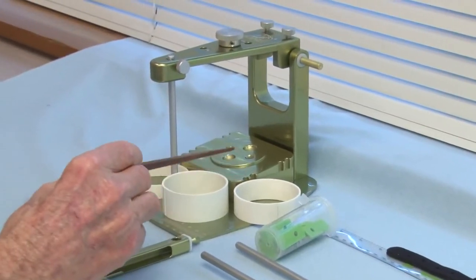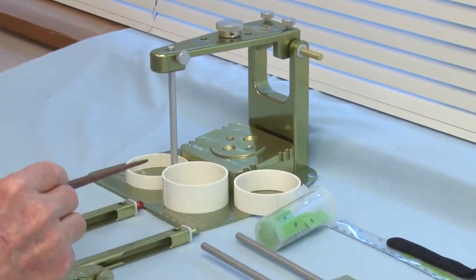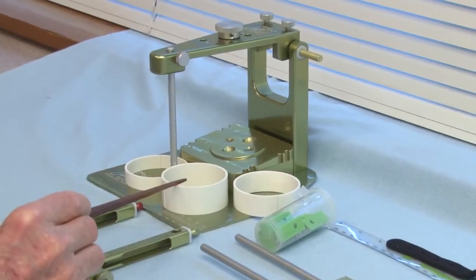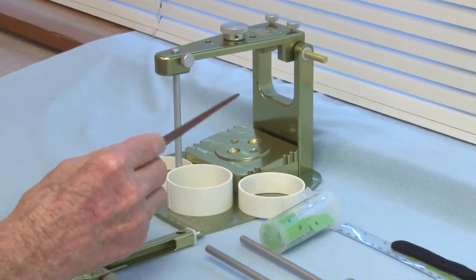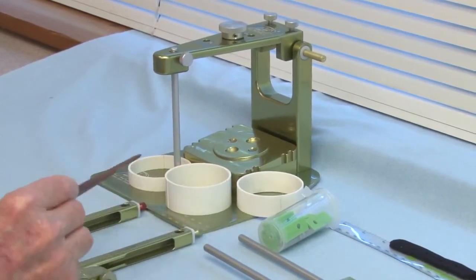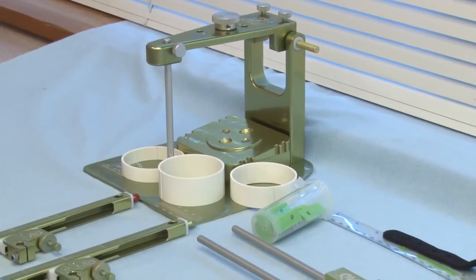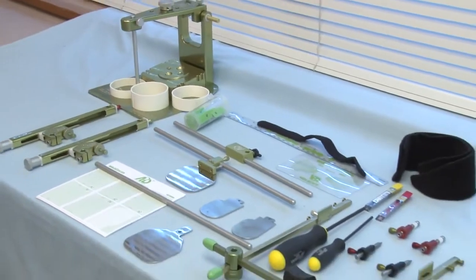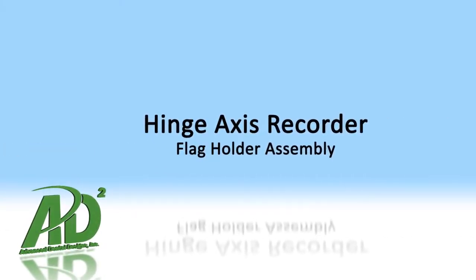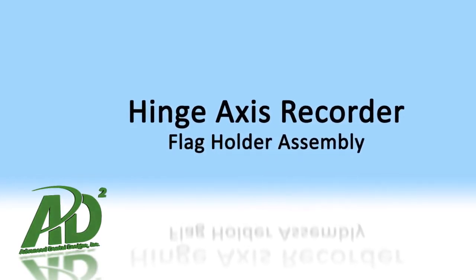And then we have our hinge axis mounting stand and 3 plastic rings that will support plaster, depending on how much plaster you need to build up to support your bite fork. So we have the 3 different sizes here. And this is basically what you get when you order the hinge axis system. Let's look at the individual parts of the hinge axis system now and how they work.